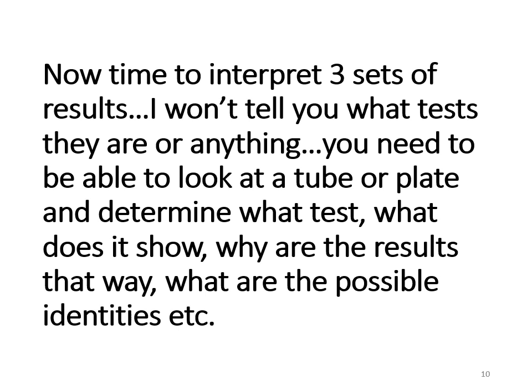So you've narrowed it down to either Agalactiae and Pyogenes, and you should then be able to tell me the next step that you would do. Okay, so don't be worried if you look at a result and you're like, oh, wait, I can't tell the exact species, I could just narrow it down. Sometimes that's the result, okay? So contact me if you have any questions while you're going through these results.